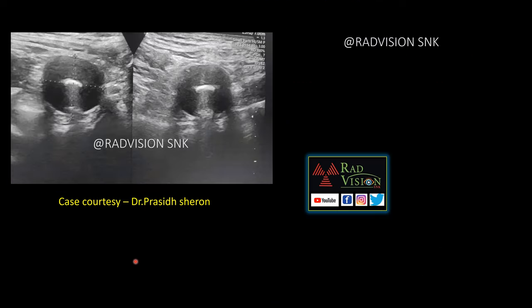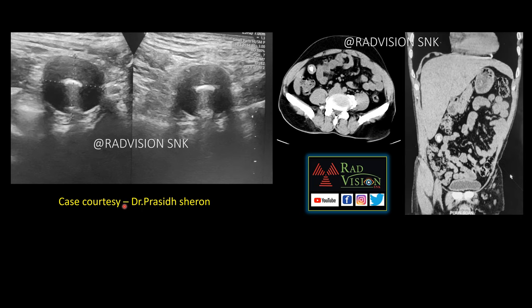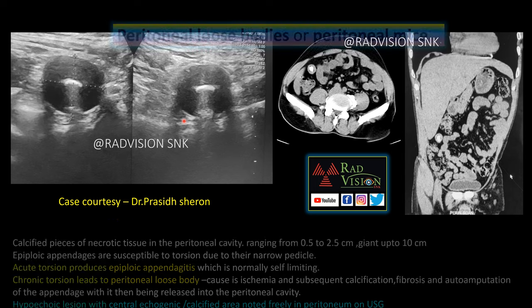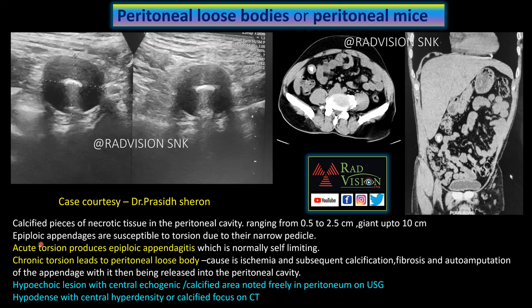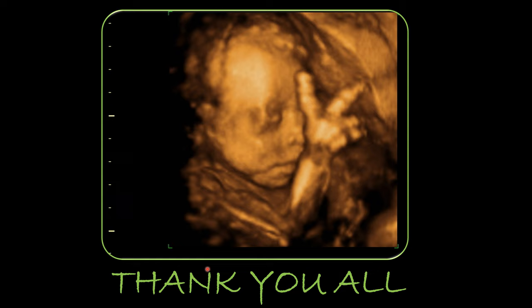Next case: a hypoechoic lesion noted in the peritoneum with a central echogenic or calcified focus, freely mobile within the peritoneum — suspect peritoneal loose bodies or peritoneal mice. Thanks to Dr. Prasid Sharon for contributing this case. On CT, this appears as a hypodense lesion with a central calcified focus, close to the right lobe of the liver, freely mobile in the peritoneum. These lesions should move freely and commonly do not attach to adjacent structures. They originate from epiploic appendages susceptible to torsion due to a narrow pedicle — acute torsion produces epiploic appendagitis, while chronic torsion leads to these peritoneal loose bodies.